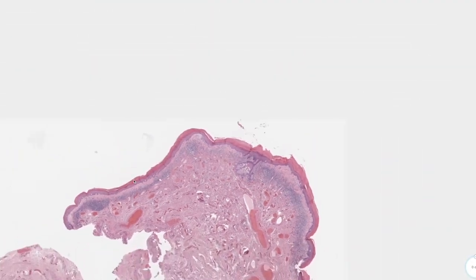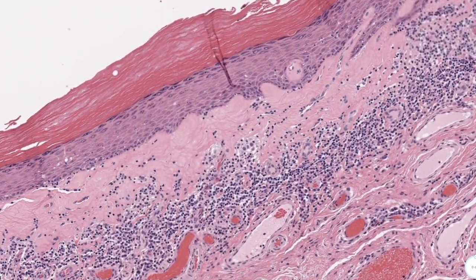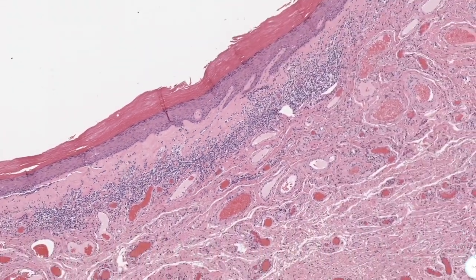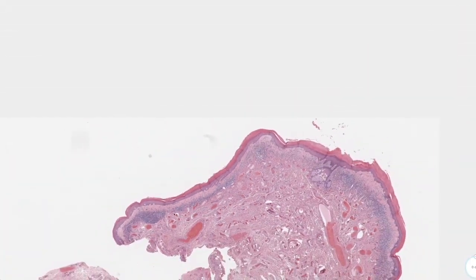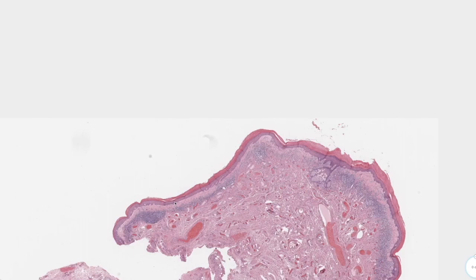We can clearly see inflammation at the dermo-epidermal junction, then thick collagen bands. There is also a band of lymphocytes that separates these collagen bundles from the underlying uninvolved dermis. At low power, we can appreciate all the key features: hyperkeratosis, epidermal atrophy, thick homogeneous collagen deposition, the band of lymphocytes, and then the normal dermis below.